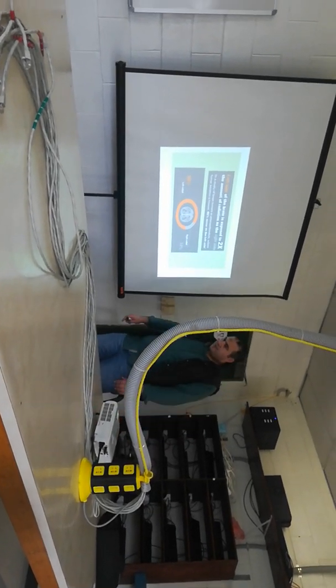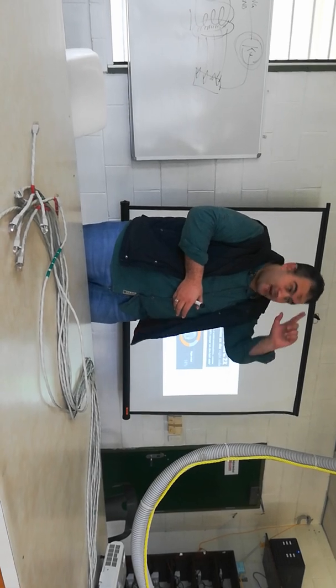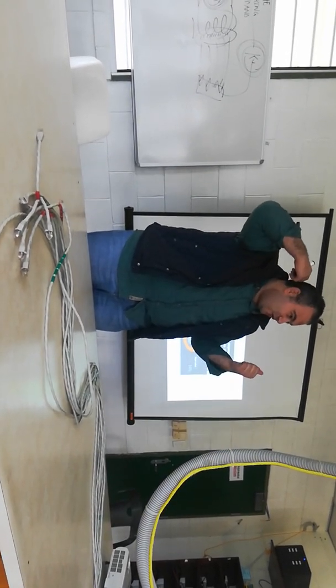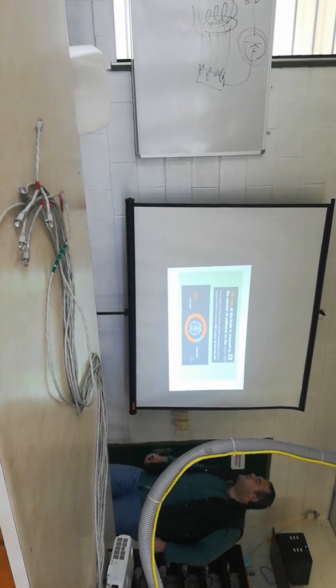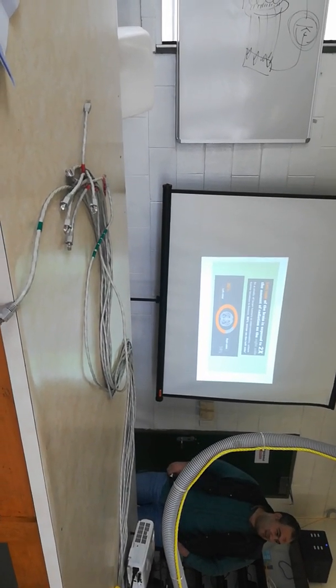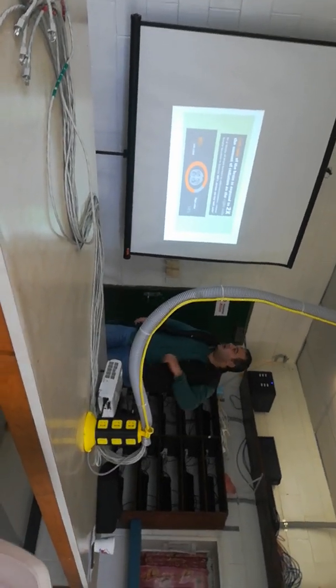They found that workers standing beside the X-ray tube on the left side have the left side of the brain exposed to radiation more than the right side. The left side of the brain is exposed to twice the amount of radiation as the right side, because it is directly beside the X-ray tube.